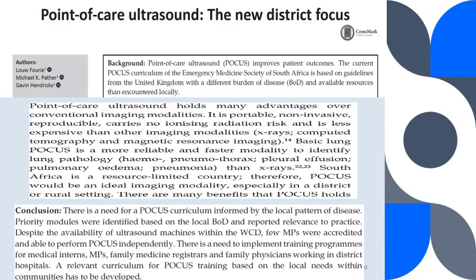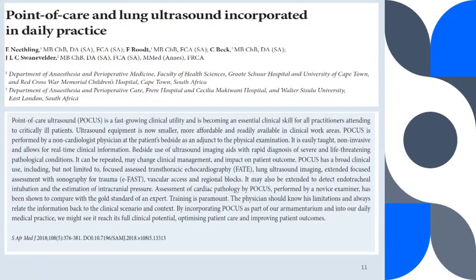This is another article that looked at point of care and lung ultrasound incorporated in daily practice. It found that one of the advantages is that it can be easily taught, it's non-invasive, it allows for real-time clinical information of these patients, it aids in the diagnosis of life-threatening pathologies, and again, it aids in optimizing our patients' care.